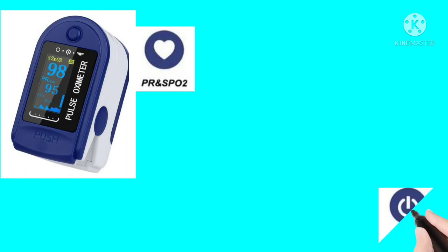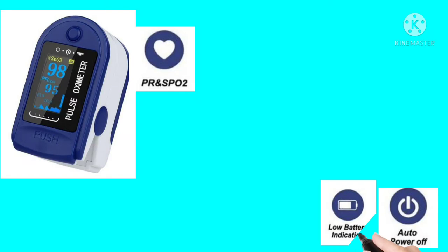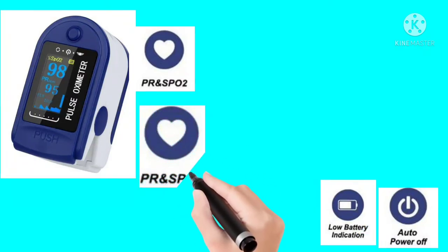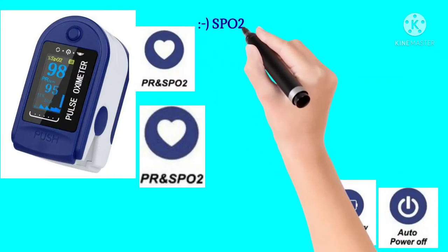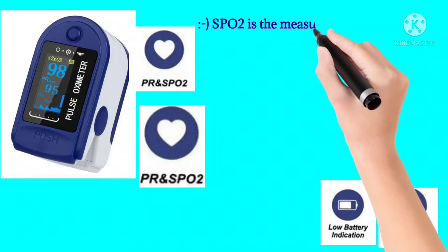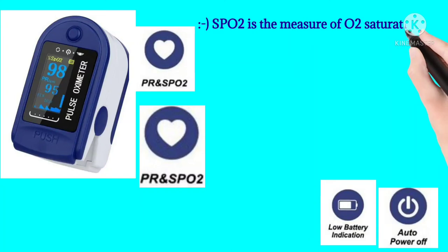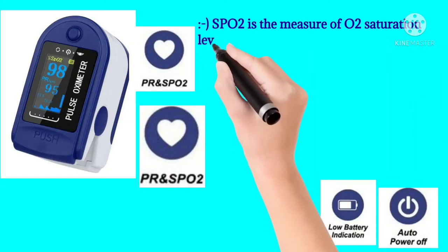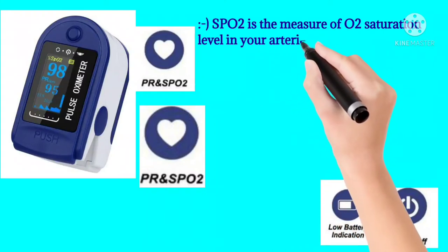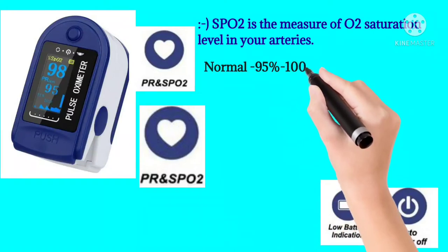The device features an auto power-off button and a low battery indication. PR means pulse rate. SPO2 is the measure of oxygen saturation level in your arteries; the normal level is 95 to 100%.